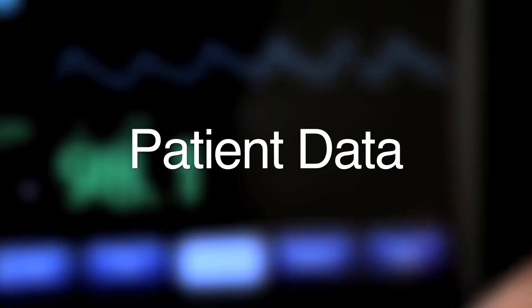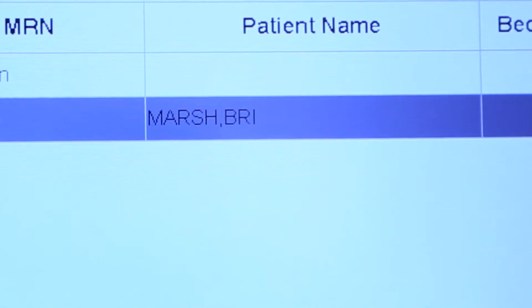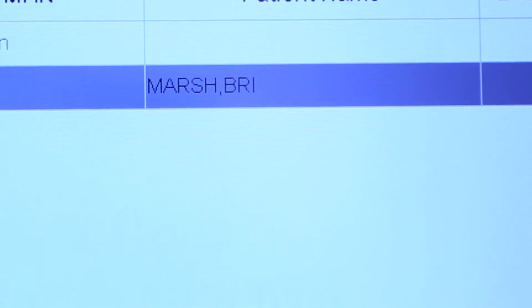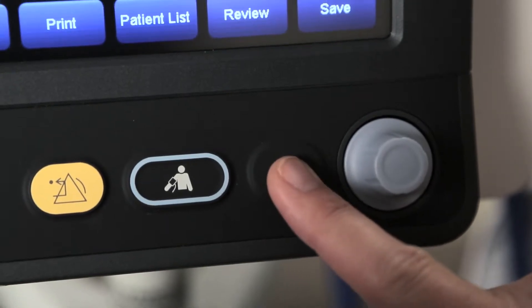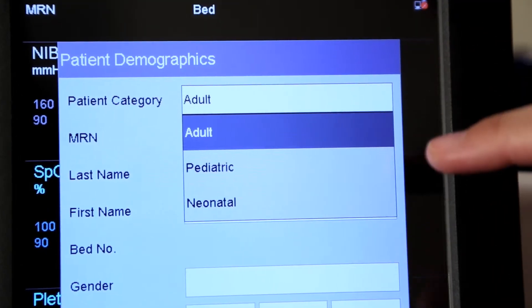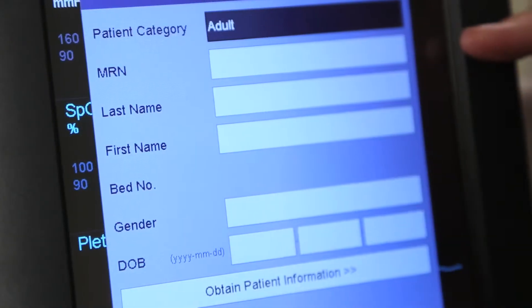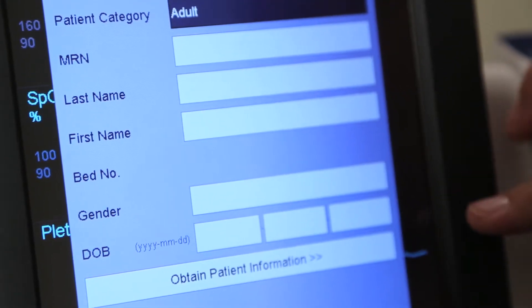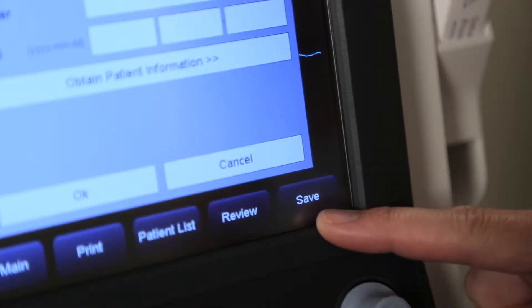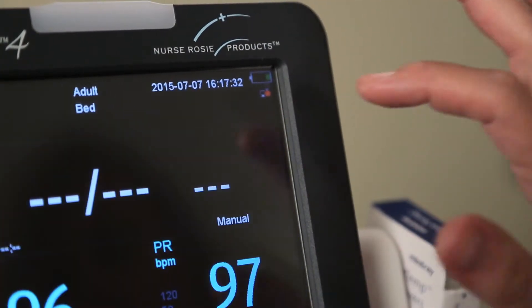Rosie 4 allows you several ways to admit a patient: select their name from a list through EMR connectivity, scan their barcode, or manually enter the patient information. Today we will demonstrate how to manually enter a patient. Press the patient hard key to access the patient demographics menu. Enter the patient's category — adult, pediatric, or obstetrics — medical record number (MRN), last and first name, bed number, gender, and date of birth. Select the save soft key to manually save patient information and select the X to save the configuration and exit the menu.